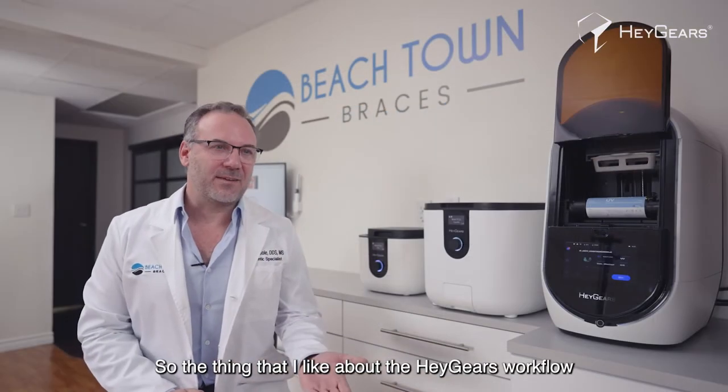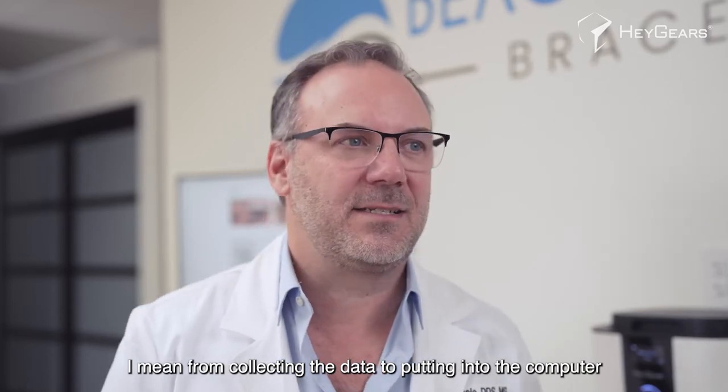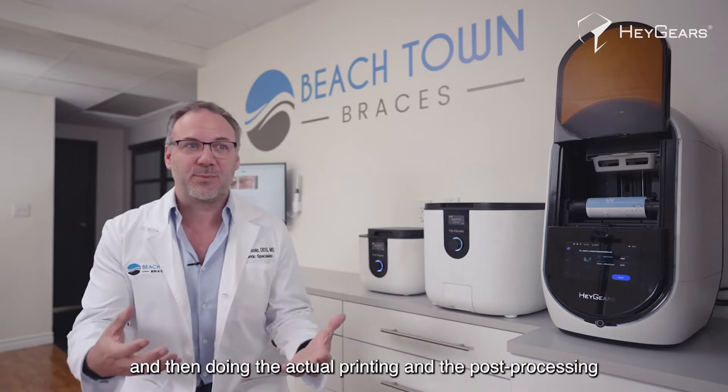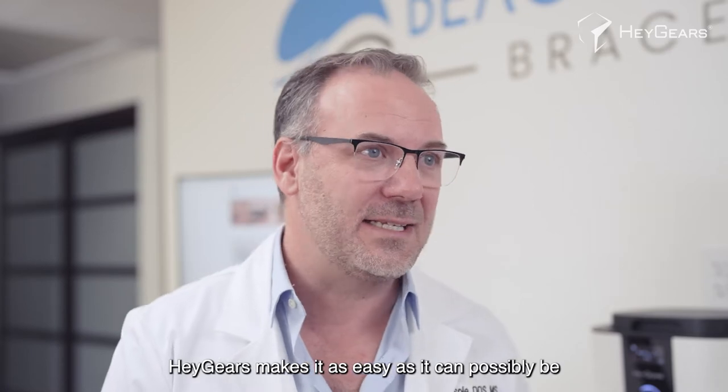The thing that I like about the HeyGears workflow is they make it as easy as possible. From collecting the data, to putting it into the computer, to working through the data, to setting it up for printing, and then doing the actual printing and post-processing — there's a lot, but honestly HeyGears makes it as easy as it can possibly be.